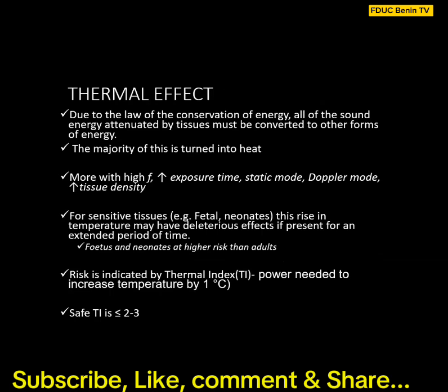Thermal effects: the major part of the sound wave, when passing through, turns into heat. It is usually more with high frequency, increased exposure time, Doppler mode, and increased tissue density. These produce more heat. That's why, when you are not scanning, always remove your probe, because increased exposure time can produce heat. Doppler mode also produces heat. That is why Doppler is not advisable in early pregnancy; you don't use Doppler ultrasound in early pregnancy because of the heat produced.